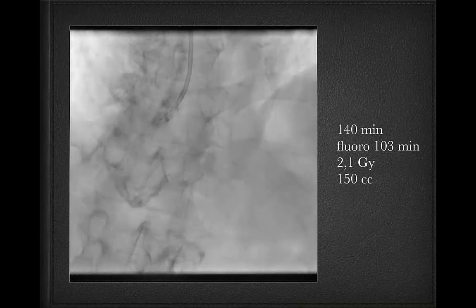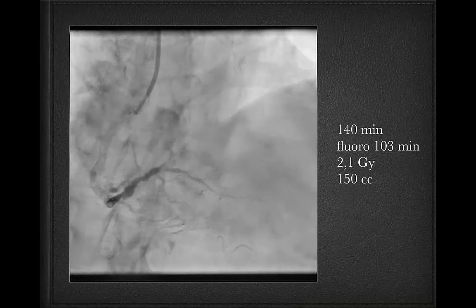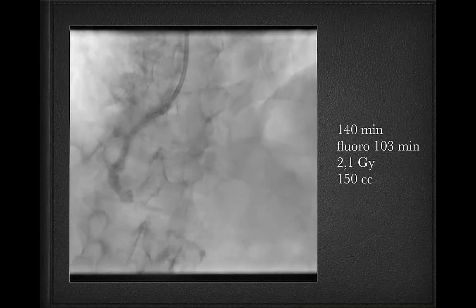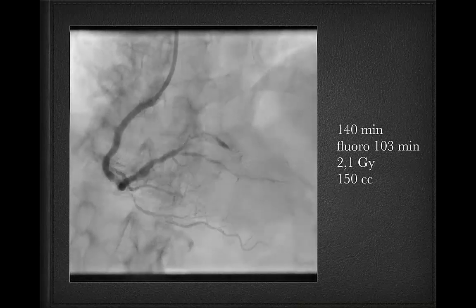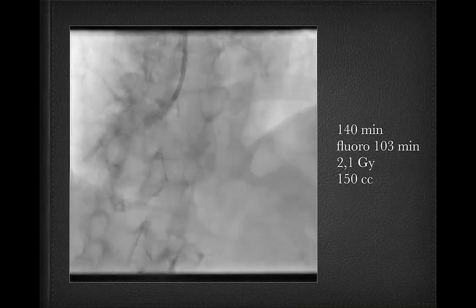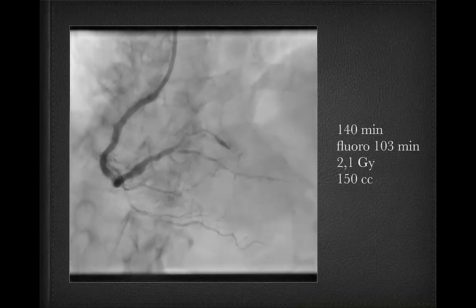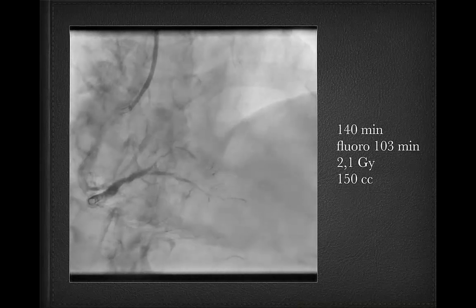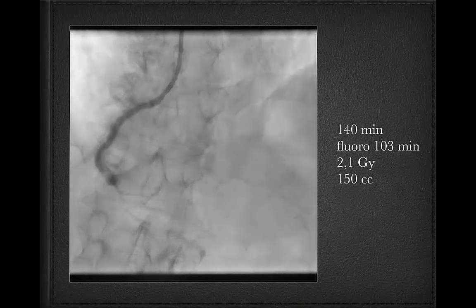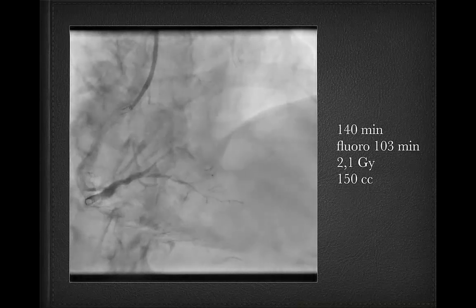Yeah, this is a phenomenal case, and also here you said is you had the severe calcification and very proximal disease. Essentially, how to drill your way back and coming out. But the nice thing is you could do a balloon and do a reverse CART, modified reverse CART in a way here, right? If you couldn't get a balloon in, then you do like the first case, just try to push the wire out as much as you can. Absolutely, but the difference with the first case is that we have no stent inside. Yeah. So if you push and you are subintimal, it could be dangerous.